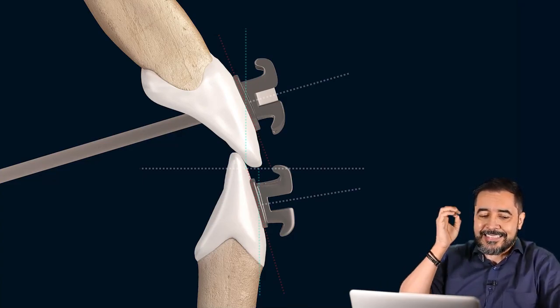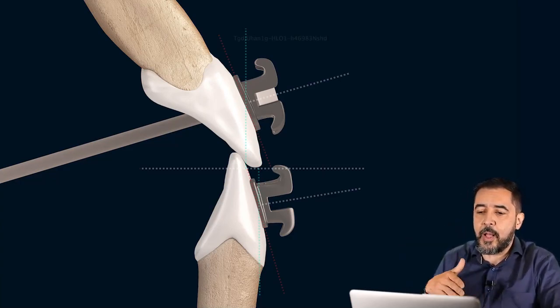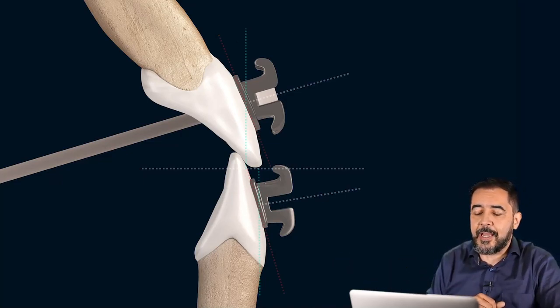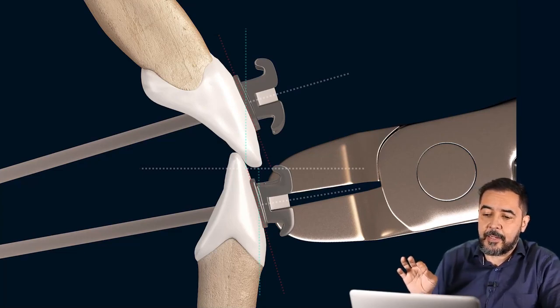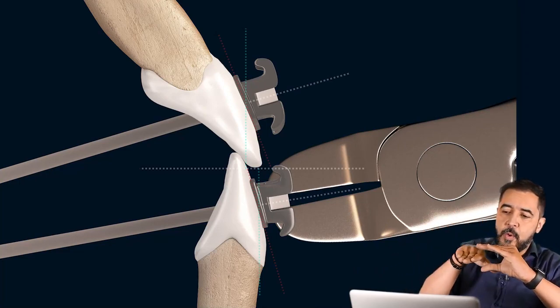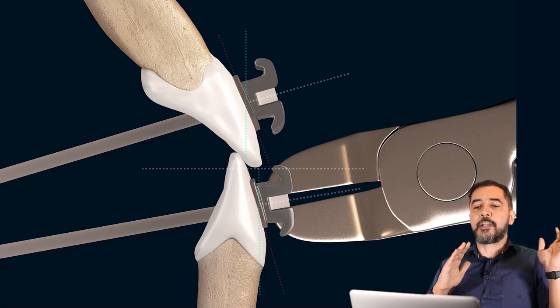It will disturb the position of the incisors, which was very well compensated. The camouflage that you did till now was okay, and now you will do a very bad thing to your treatment. So we are applying the same concept here with zero neutral torsion of the arch wire, which is going to be inserted inside your slot, and your slot is very inclined.